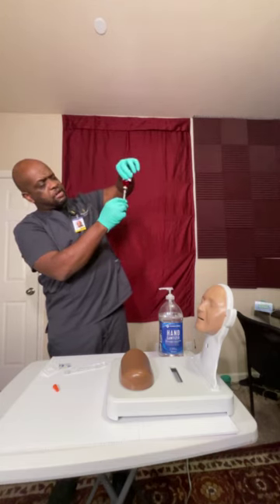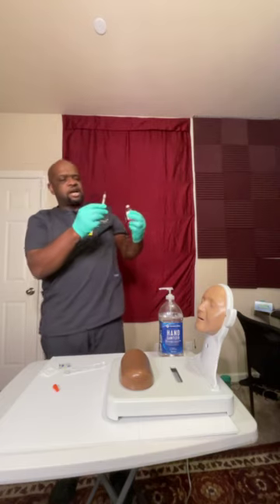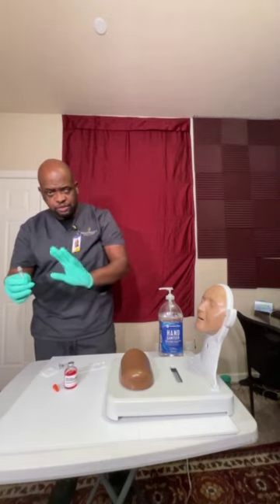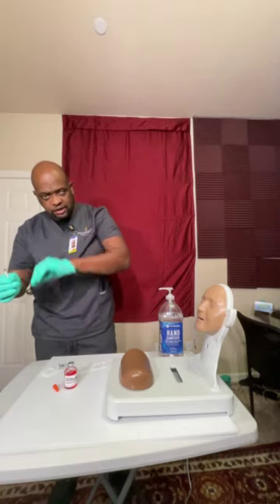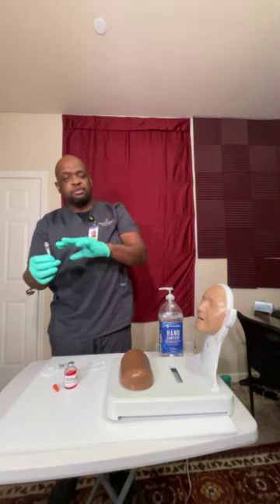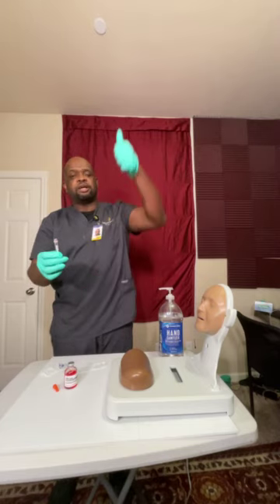There were no air bubbles, by the way. As I said, leave the syringe inside of the medication bottle. If there are air bubbles, tap to make sure that the air bubbles go back in. If there are too many air bubbles, you'll push all the medication back in and then redraw.